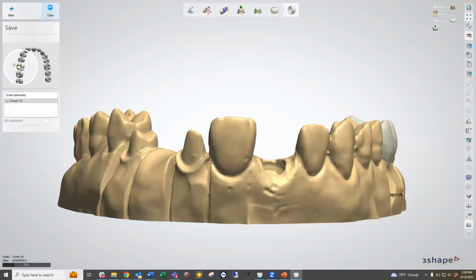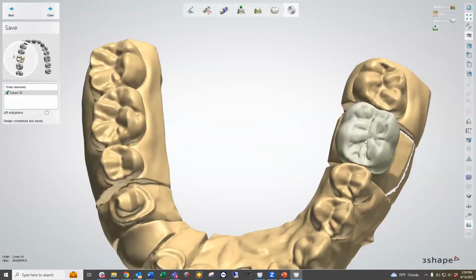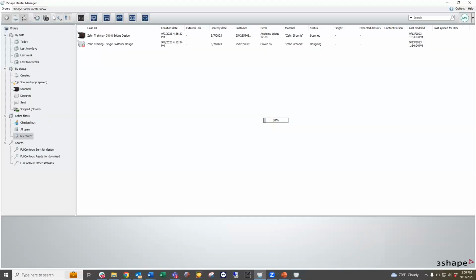Now at this point, if we had any parts of the unit or any elements of our crown that were deficient as far as minimum thickness, it would give us some warnings, allow us to go ahead and manually or automatically adapt those areas as needed. Okay, so that is the single crown design. Let's go ahead now and take a look at the 3-unit bridge design.